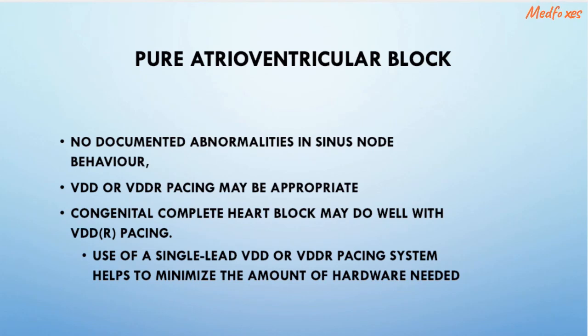For the patient with pure AV nodal disease, that is, no documented abnormalities in sinus node behavior, VDD or VDDR pacing may be appropriate. Specifically, the patient with congenital complete heart block may do well with VDDR pacing. In pediatric patients, from a hardware perspective, use of single lead VDD or VDDR pacing systems helps to minimize the amount of hardware needed.